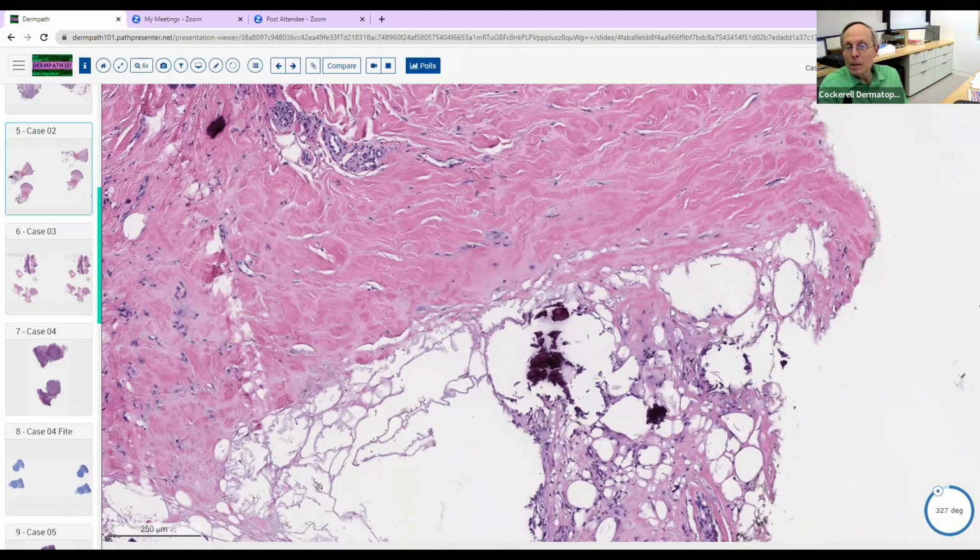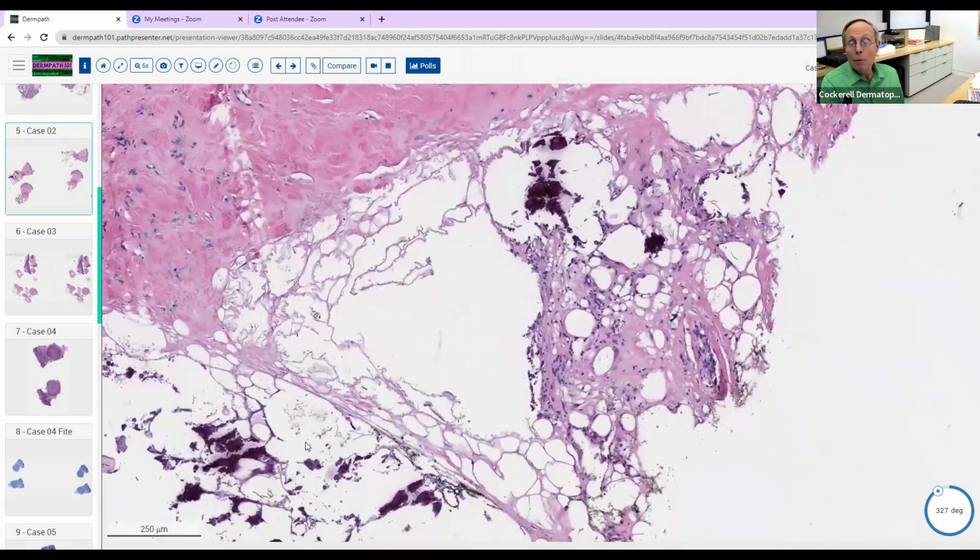And if you see the lobular panniculitis with fat degeneration, not usually the membranous fat necrosis, but more that hyaline pink fat necrosis, you maybe think about lupus erythematosus profundus. But this was an example, based on the clinical information we had here, of a deep variant of morphea that just also had lobular panniculitis with dystrophic calcification. And we know that patients with morphea and CREST, things like that, can get calcification. So you can get dystrophic calcification in connective tissue diseases fairly commonly. Dermatomyositis can get it, CREST, obviously. So basically, this was an example of morphea profunda with panniculitis and dystrophic calcification.